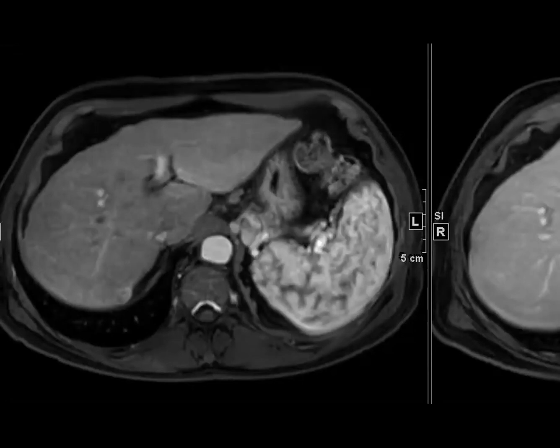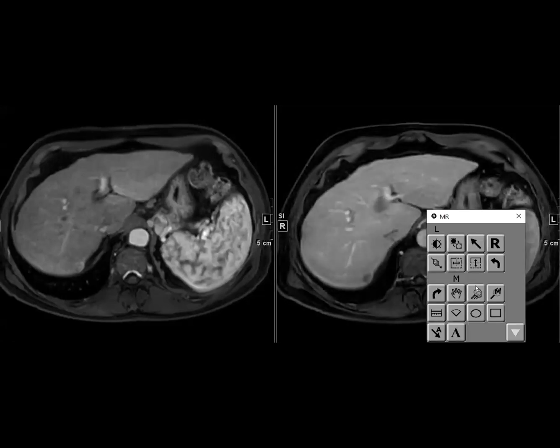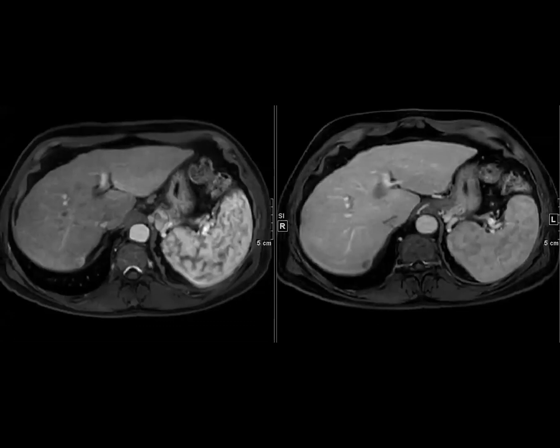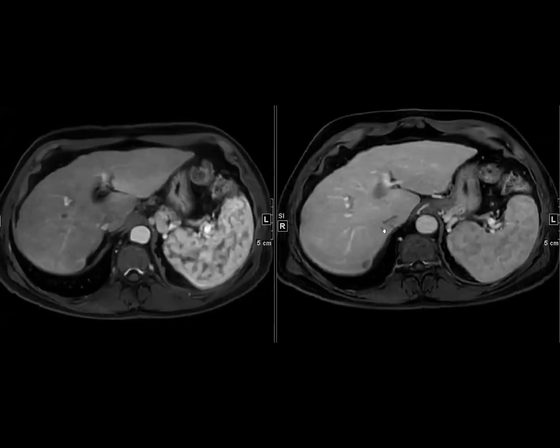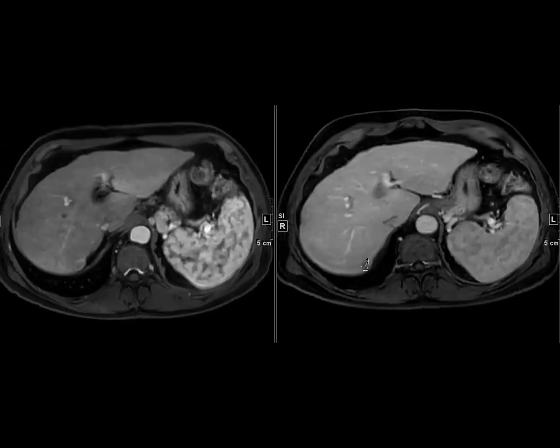We do. Okay. So I figured I'll stick to things I know best, which is liver. So we'll start with this case. The patient is cirrhotic, and this was about last spring, and there was a lesion, about 1.2 centimeters. So if you were to use LI-RADS, what do you think you would give as a category?